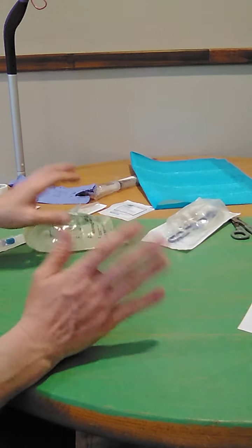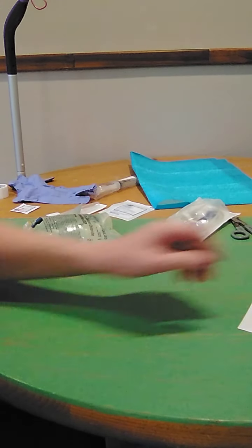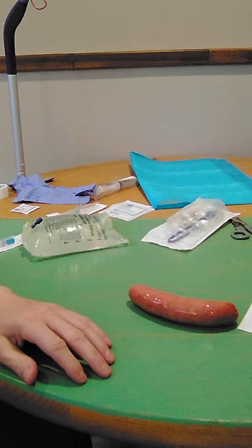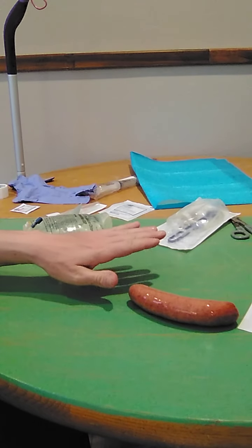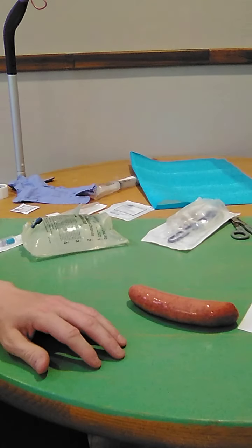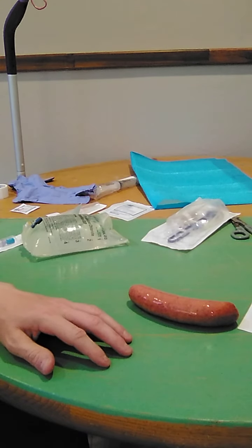So I'm going to approach the patient and identify the patient with 2 identifiers. In this return demonstration, my model patient is going to be this sausage to simulate something having a penetrable skin, a surface that I will approach as if it were a live patient, and it's actually a pretty good model for this demonstration. So now I'm identifying the patient with 2 identifiers, being his name and date of birth. So this is John Doe.